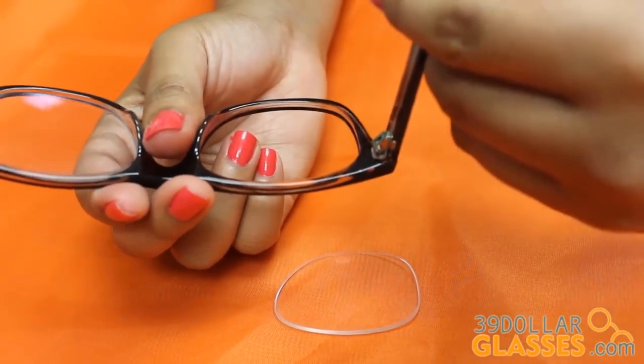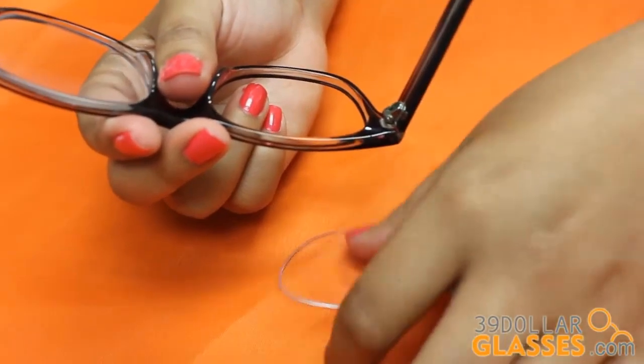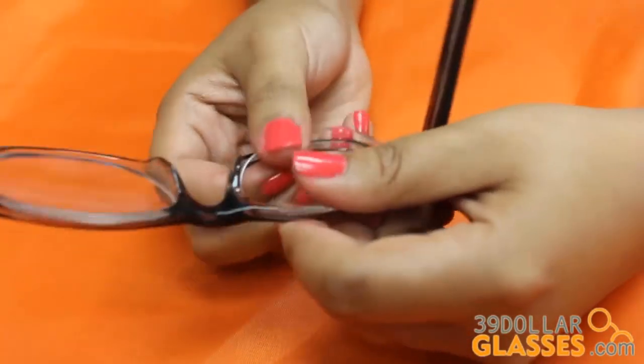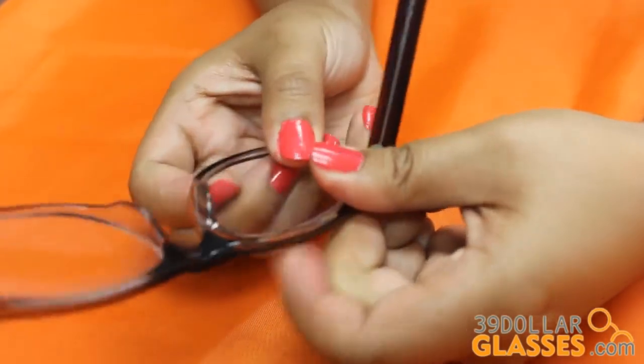In order to insert lenses, it is important to transfer lenses only if you are using the same style of frame, to ensure that the lenses fit in correctly. Place the lens in the inside corner of the frame and work your way around while pushing the lenses into the frame using your thumbs and pulling the top and bottom frame with your index fingers.